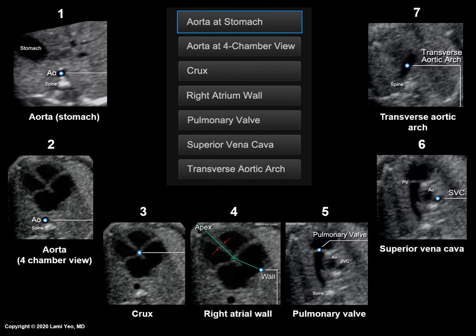The seven cardiac structures are: the aorta at the level of the stomach, aorta at the level of the four-chamber view, crux, right atrial wall, pulmonary valve, superior vena cava, and the transverse aortic arch.